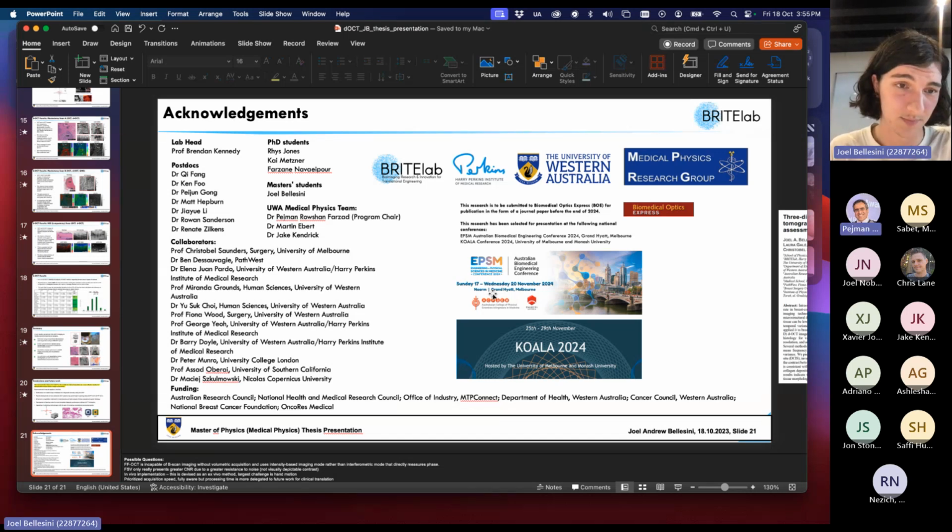Did I answer it? So the other question I have is that your OCT images are suffering from noise. So what was your strategy for future work to reduce the noise substantially before starting to assess the data? So yeah, OCT is obviously susceptible to optical noise, and our penetration depth is quite small, so the point at which we have a high SNR, where noise doesn't become terribly involved, is quite superficial.